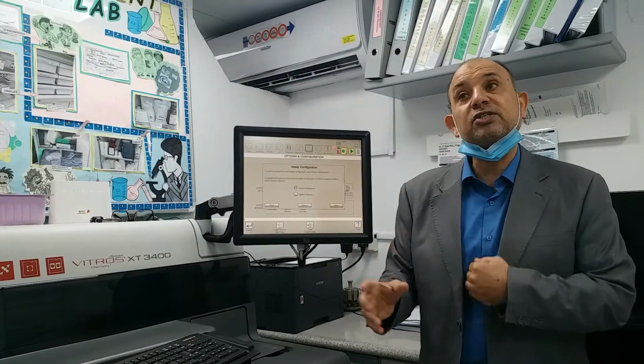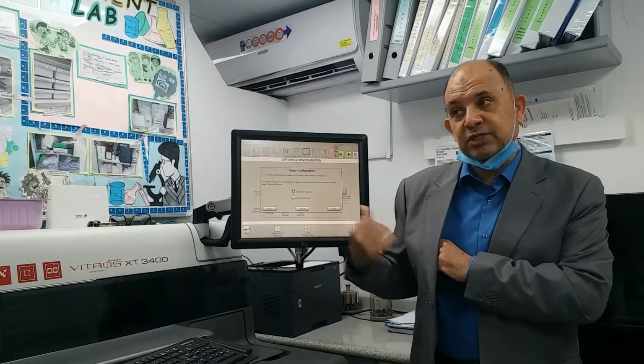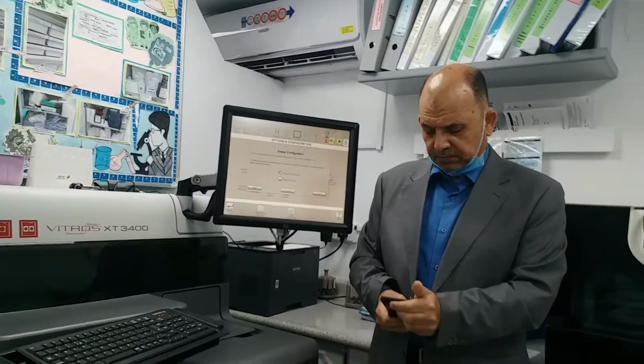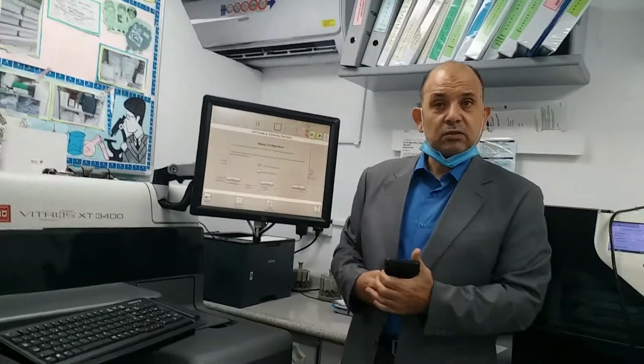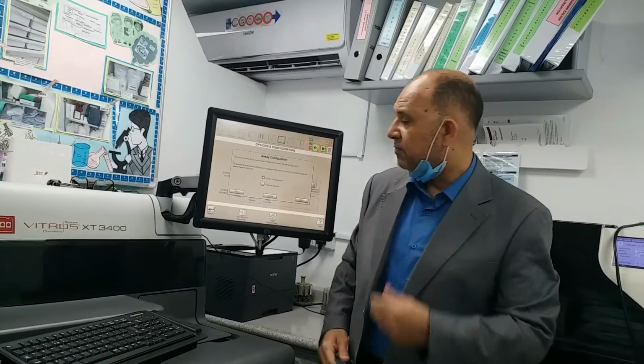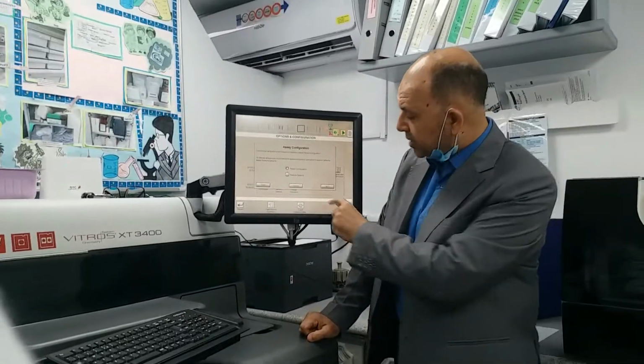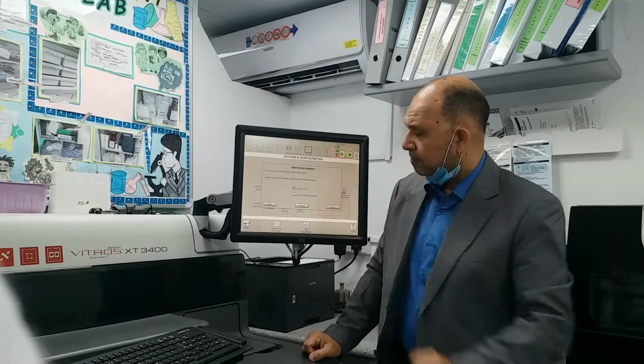Did any of you change something on it? Still no? No one changed it? Okay, very well. So I'll keep retain configuration. That means the running configuration which I have, I'll keep it right now. Next to that, I'll say just next.